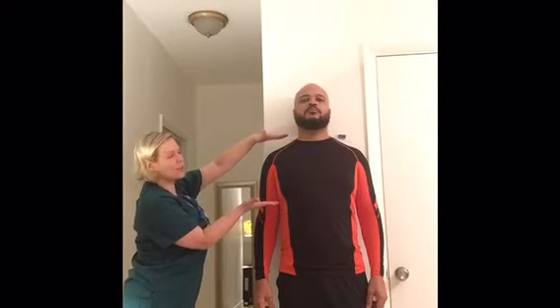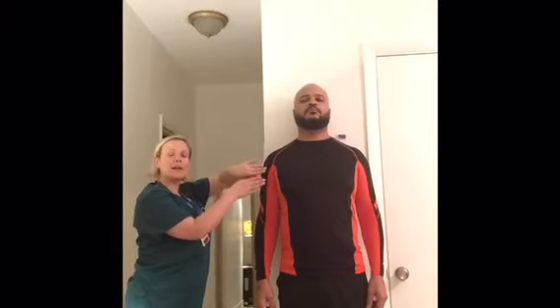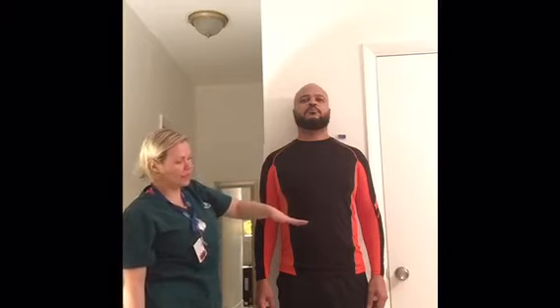Then you just put it lower and make sure that you overlap the first image with the second image to have the full picture. So the xiphoid process right here, and it will be to the end of the ribs.